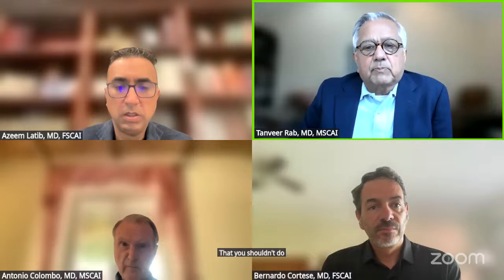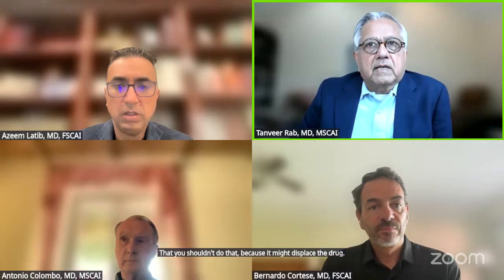Okay, great. So I had a couple of questions to ask. So do you ever go back with balloons or IVUS after you put a DCB? There's some thought that you shouldn't do that because it might displace the drug. And secondly, compared to the balloon angioplasty era, we have very potent dual antiplatelet agents, particularly prasugrel and ticagrelor. And I think the risk of abrupt closure probably due to that factor may be lower.